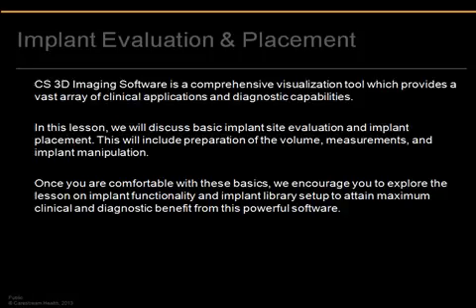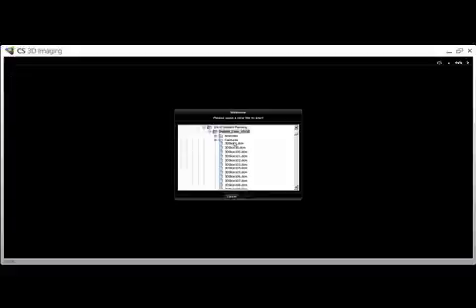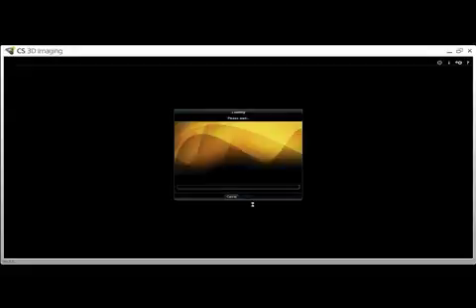In this lesson, we will focus on implant evaluation and placement. To begin, double-click the CS3D imaging icon to open, then single-click the first DICOM slice of the appropriate scan and click OK. This will open the patient's CBCT scan.